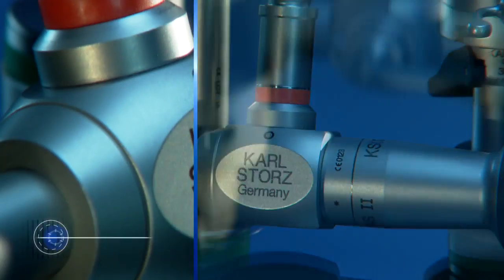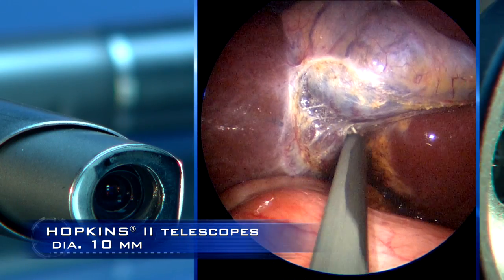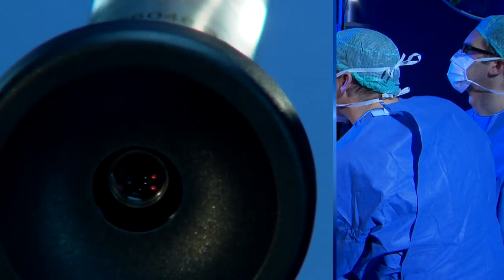The 10mm Hopkins II telescope offers the user brilliant HD image quality and is thus usually used as the standard telescope in mini-laparoscopic interventions.